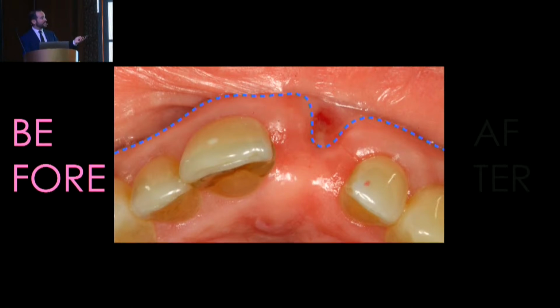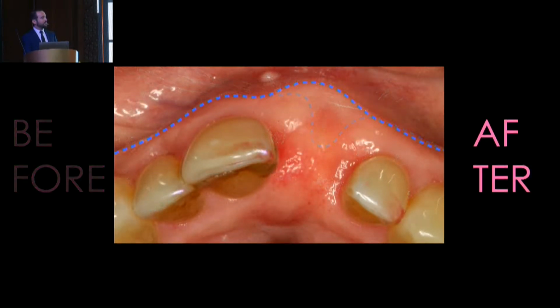Here we have a comparison on an occlusal view of how we had it, the clinical presentation before the surgery, and how with a small, simple procedure, we were able to augment the bone in order to create a more ideal structure for future implant placement.